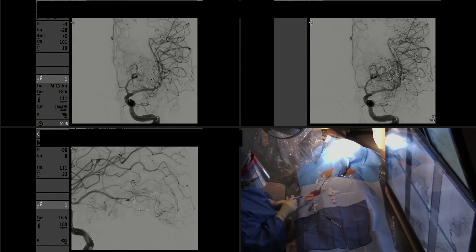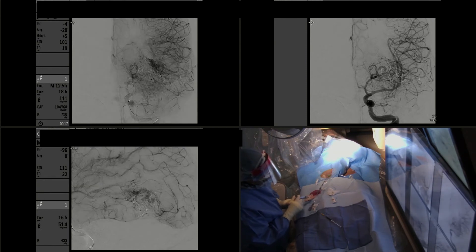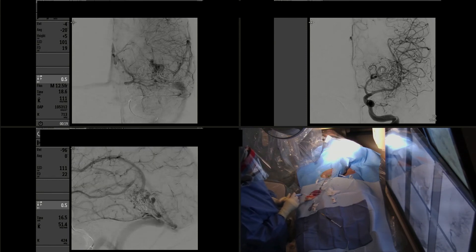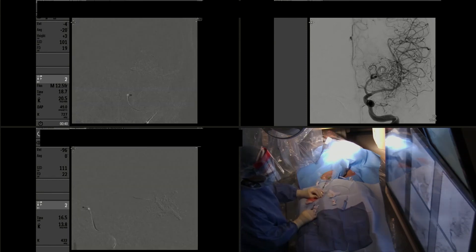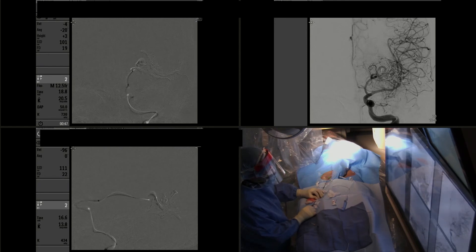This is a control angiogram showing that there has been significant devascularization of the arteriovenous malformation at the end of the injection, and now we thought that it was a very appropriate result after embolization.